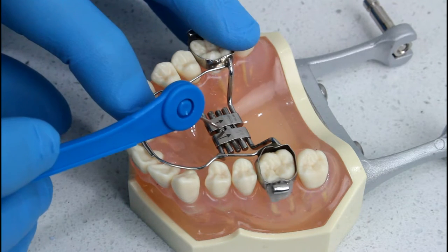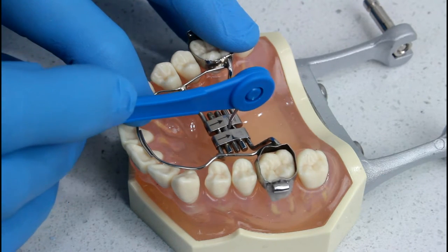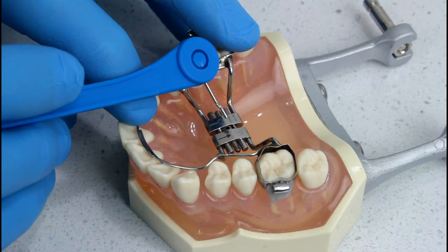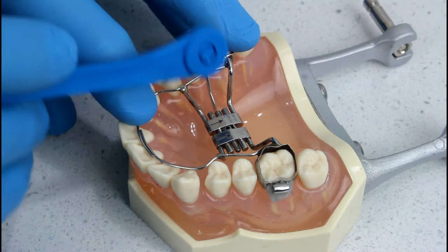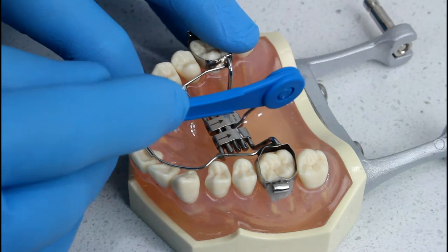Some people make the mistake of turning to the back but then, instead of taking the key out backwards, they start to pull it back towards the front — so they've really only done half a turn. To correct this, you need to find and replace the key in the hole and turn it all the way backwards the rest of the way.